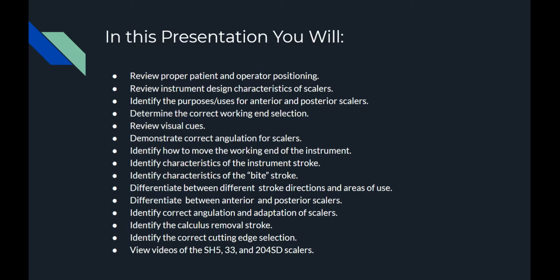differentiate between anterior and posterior scalers, identify correct angulation and adaptation of scalers, identify the calculus removal stroke, identify the correct cutting edge selection, and view videos of the SH5, 33, and 204 SD scalers.